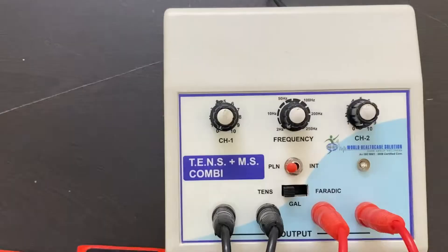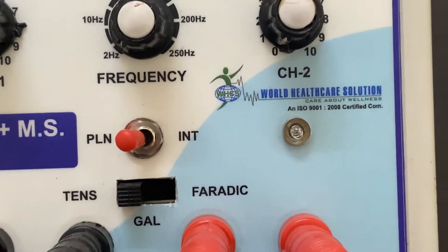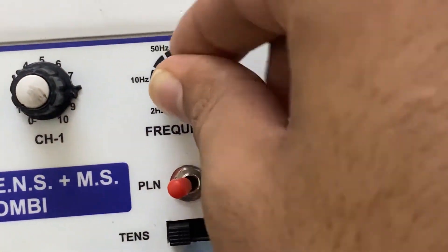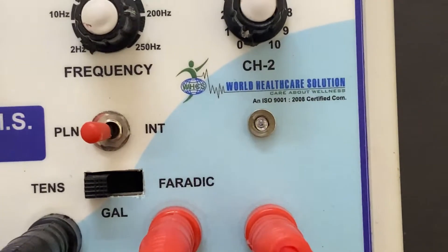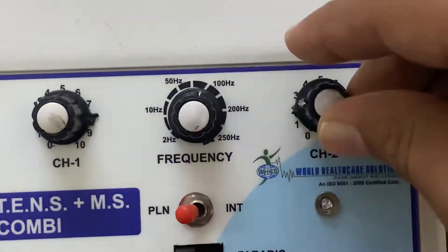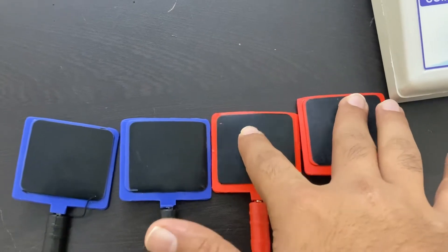Set the intensity as per your need. Once you increase the intensity, you will see the blue light blinking, which shows how the current flows through the electrode. You can also set the frequency as per your need. Once the frequency is set, you will see a change in the light — this is how the current flows through the electrode. You can simply check the intensity by placing your hands.